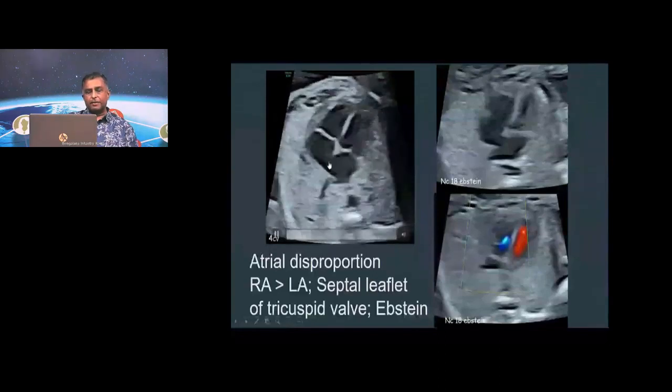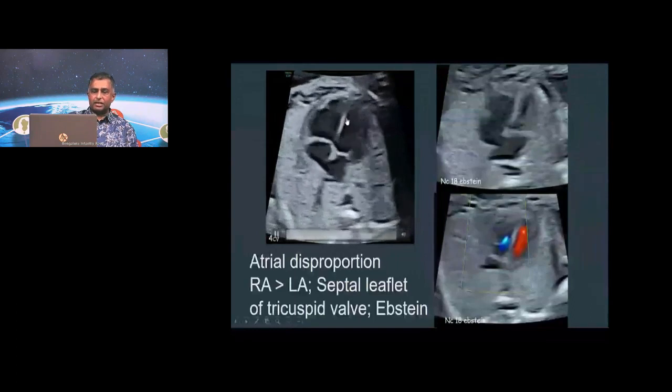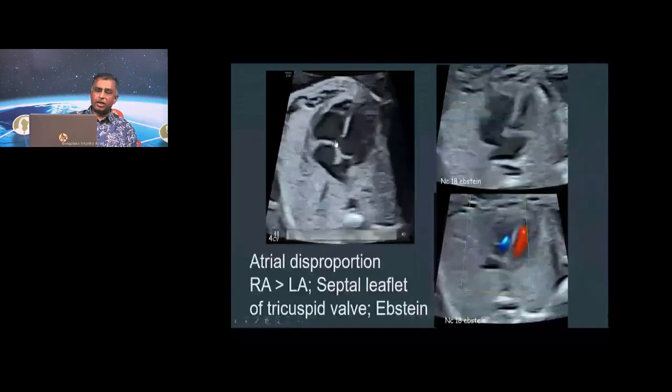So this is the interventricular septum. This is the interatrial septum. This is called the septum primum, or the drumstick, which is very important to recognize. This is the foramen ovale over there. This is the tricuspid valve closer, the mitral valve further. So you have the interventricular septum here, and the interatrial septum here, and this small little bit over here, thanks to the offsetting of the tricuspid versus the mitral valve, is a small segment of septum which is separating the right atrium from the left ventricle. So this little septum is actually the AV septum. The AV septum, atrioventricular septum, interventricular septum, and interatrial septum.